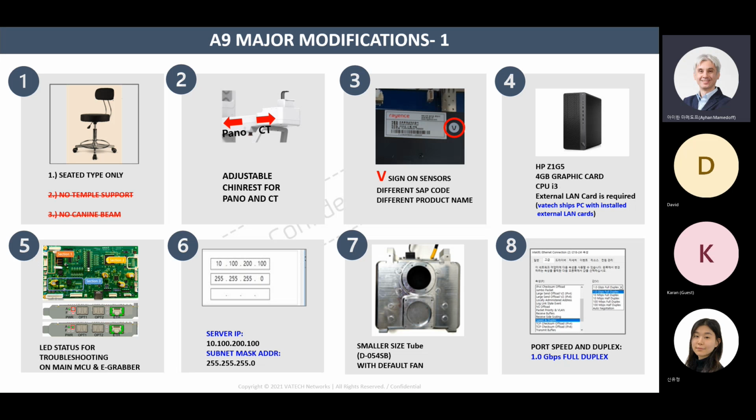sections. So first, in order to save time, I just made this short summary so you can see the major modifications that were made on this A9 model. And later I will explain why we named it A9, and I will show you the hardware and software installation procedures, and then I will let you know about the console software modifications too.